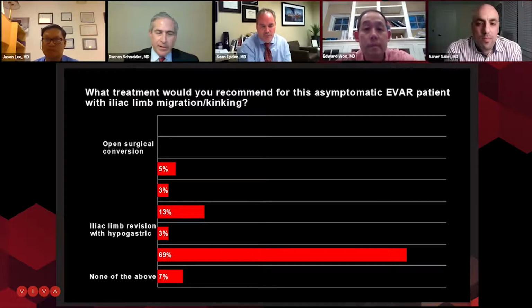So I think that just deciding to follow him because he doesn't have an endoleak and a stable AAA and he's asymptomatic is the wrong answer, because I do think this is someone who's at risk, impending risk potentially, to come back with a rupture, like Ed said.